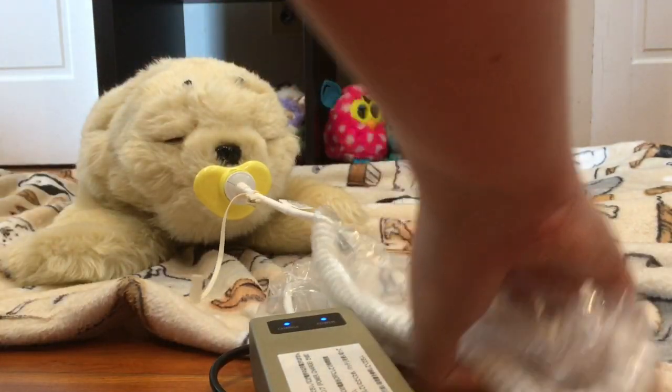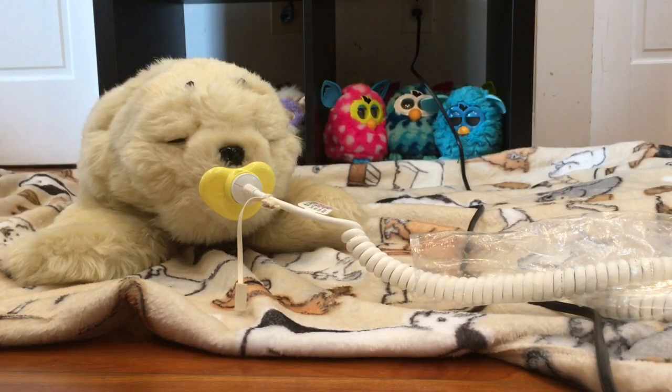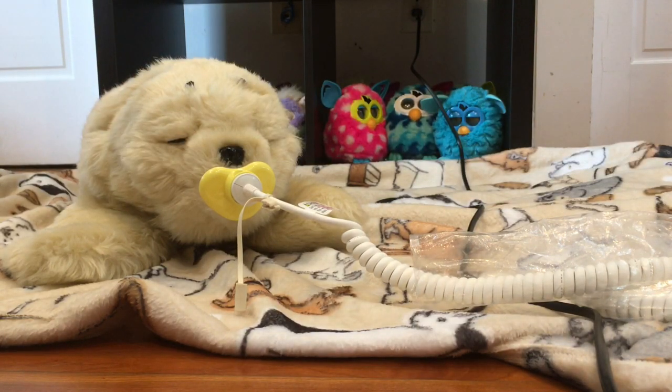One thing I'm not a huge fan about with this design is that the plug here does not stay in well at all and can fall out very easily. So you have to sometimes check back on the charge light and make sure that it's still lit up, because if it gets loose it'll stop charging.